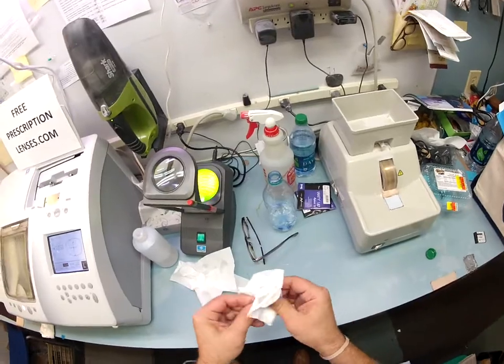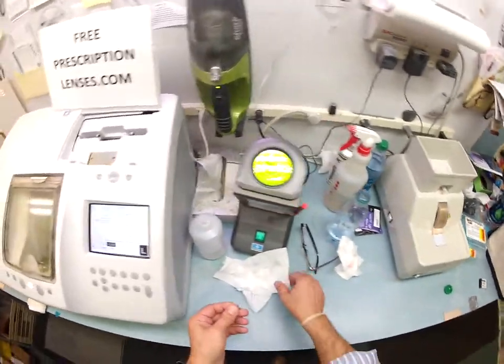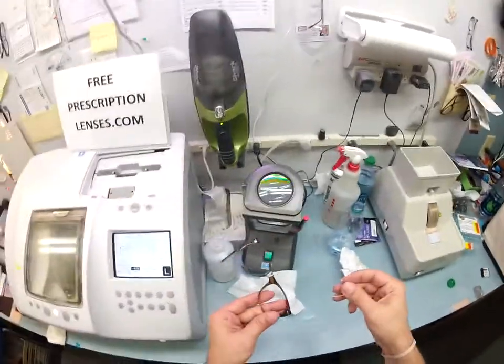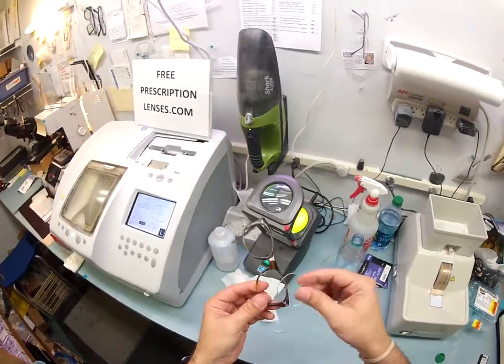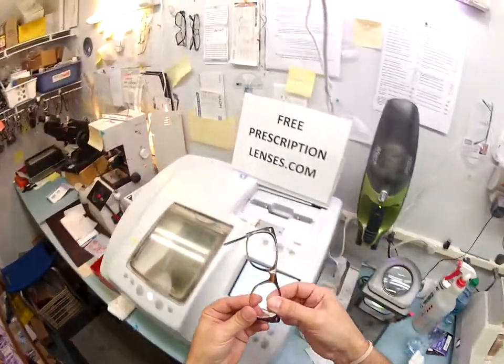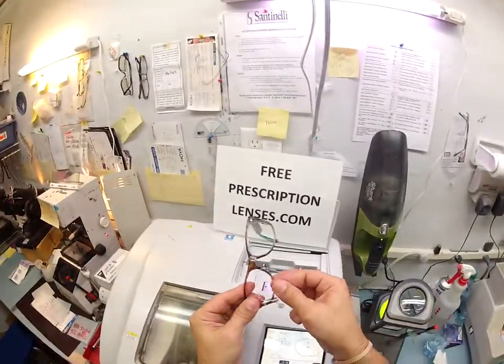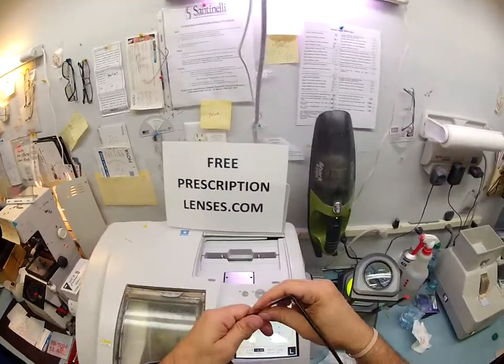And actually, let me give you one more course on how to mount your lenses. Dry everything off again. So when you receive these, you're going to take them out of the protective sleeves, so that you're about to see me put them in. With the frame upright and working on the closest side, tuck it in at the outside corner. Using your thumbs, just press down at the nose. I rotate the frame around for the right lens, tuck it in at the outside corner. Using your thumbs, push down at the nose, and that is it.